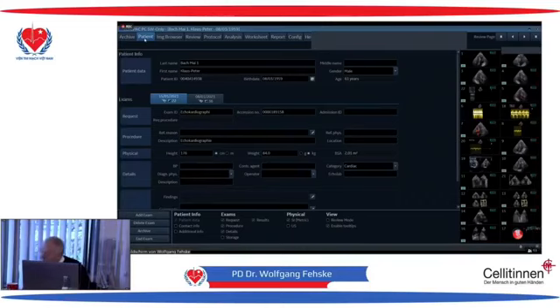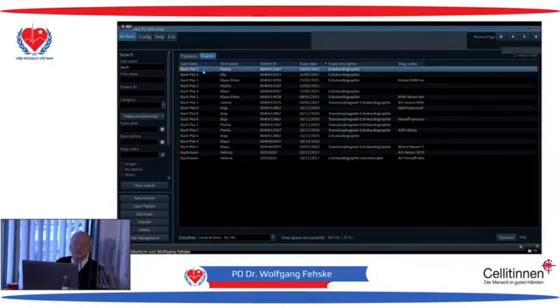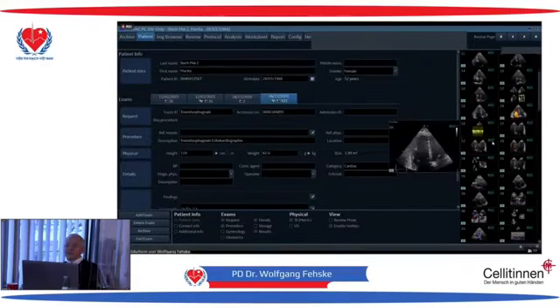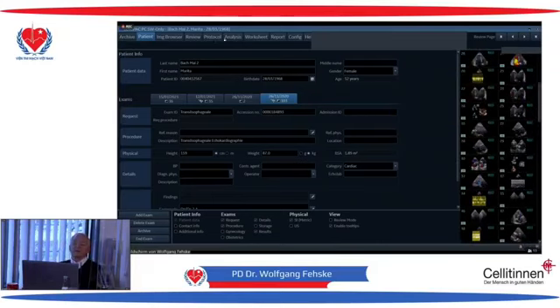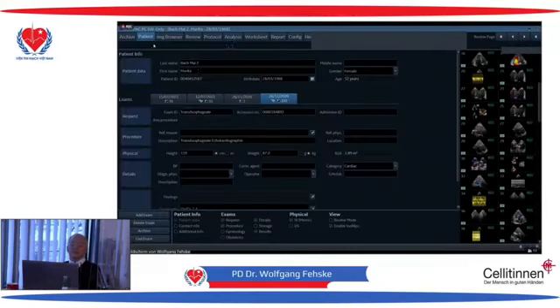May I show you another one? I will show you another interesting case, staying with the right ventricle. This is a 52-year-old lady, 160 centimeters and 87 kilograms. This is a little bit too much for her size.